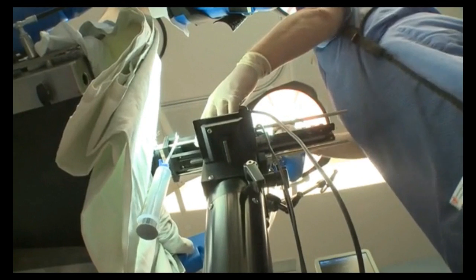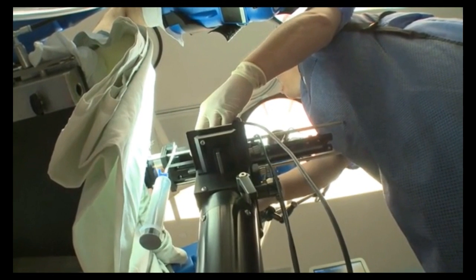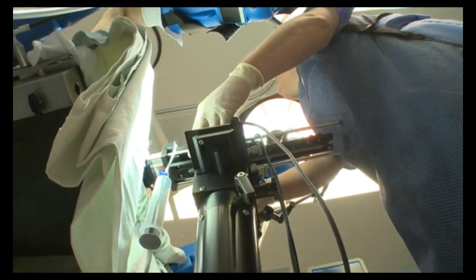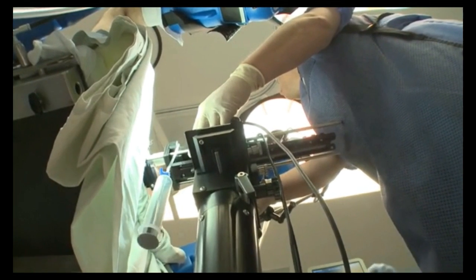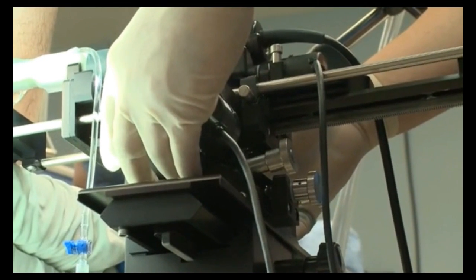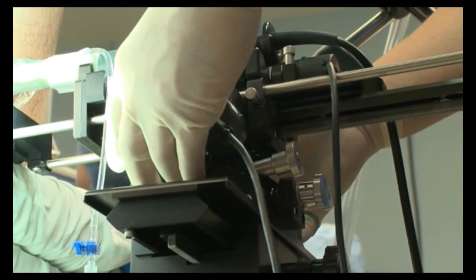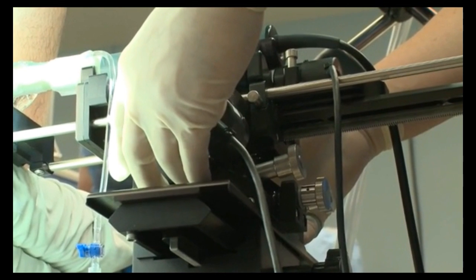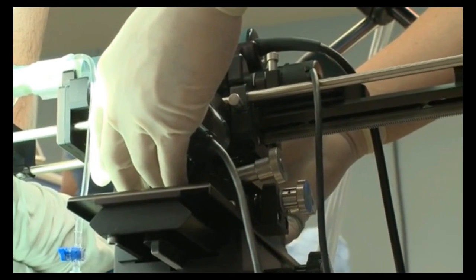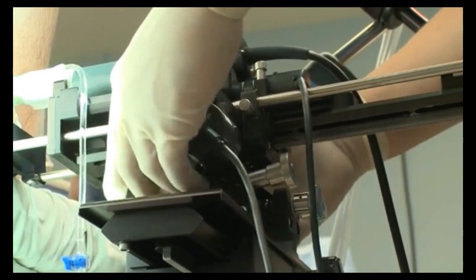The encoders that are buried in here are tracking with me. Going through sequential image captures — next, capture — stepping through each slice. If I step back then I'm seeing that I'm out of prostate. So I've got images.